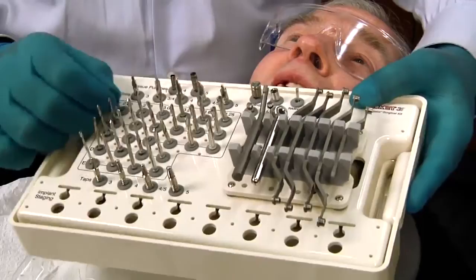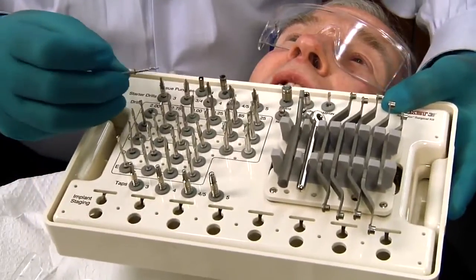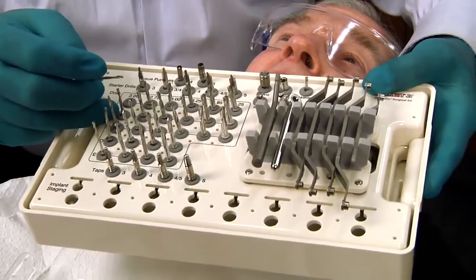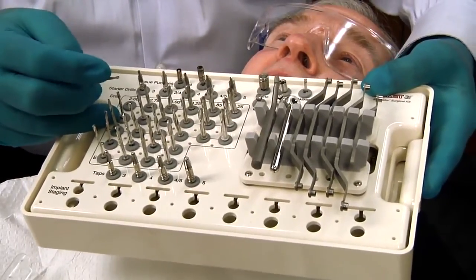Each drill has a stopper on it so that you place it all the way into the master cylinder and this stop will keep you from going too deep.